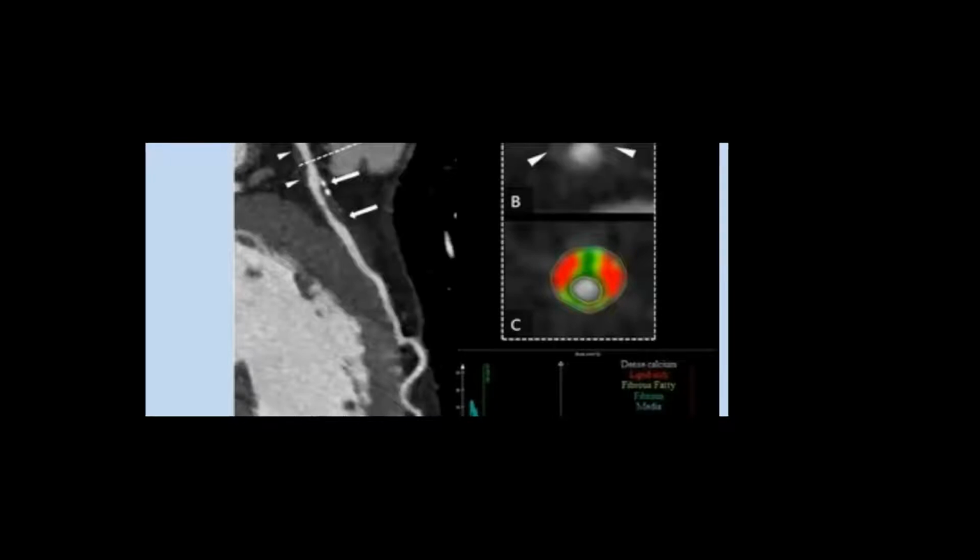One essential part of cardiac CT, which is coming strongly nowadays, is the characterization of the plaque itself. Now we are talking about not the plaque quantity, but what the components of the plaque are will decide or determine the outcome. So how much fibrofatty core, okay, and stuff like that.